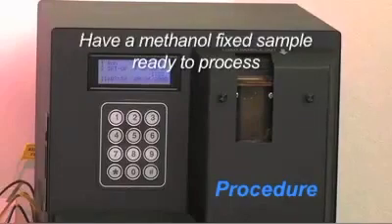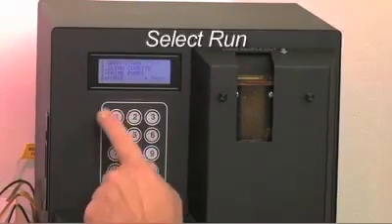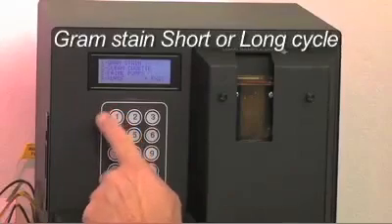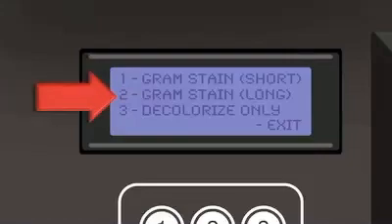Have a methanol-fixed sample ready to process. The operator is prompted by the LCD screen to select Run, then Gram Stain Short or Long Cycle. If your sample is a thin saline prep, then select Short Cycle. If a thick sputum, or until you familiarize yourself with the instrument, select Long Cycle.